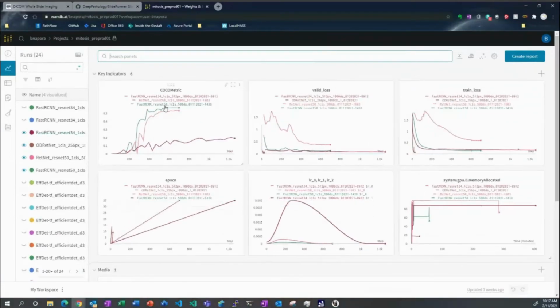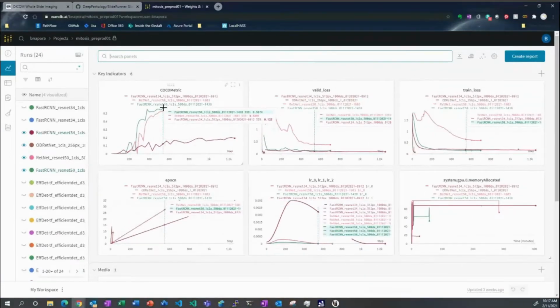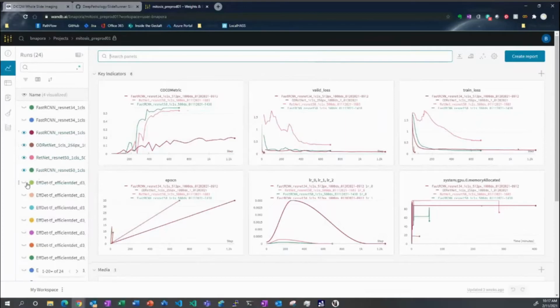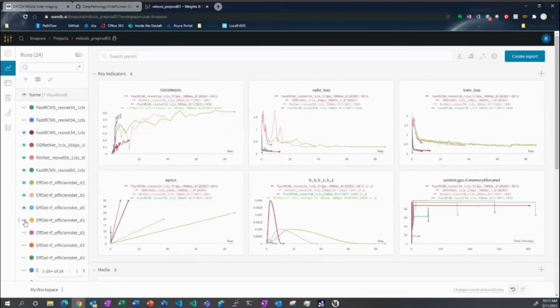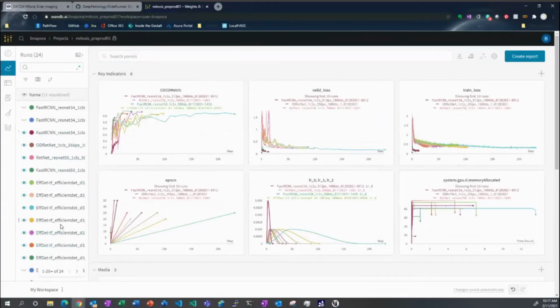But you're using FastAI, okay, I know. That's why. So like what Potipot said, you're going to have all metrics, but we only have that for Lightning. We still have to implement it on FastAI to show all the metrics as well. But what you can do, as he's saying, when you define the metric, you say print summary equals true, and then a table is printed. But the logging for FastAI on WandB with the metrics is still an implementation we have to do.